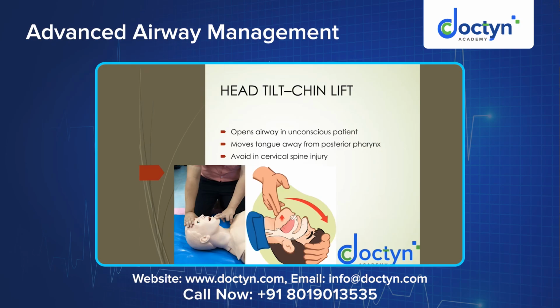And head tilt, which aligns the oropharyngeal and laryngopharyngeal axis in one line, is usually contraindicated in cervical spine injury, because head tilt leads to movement at the cervical spine. In a trauma patient, when you are suspecting any C-spine injury, head tilt is usually avoided. So the best thing to do in those patients is jaw thrust.